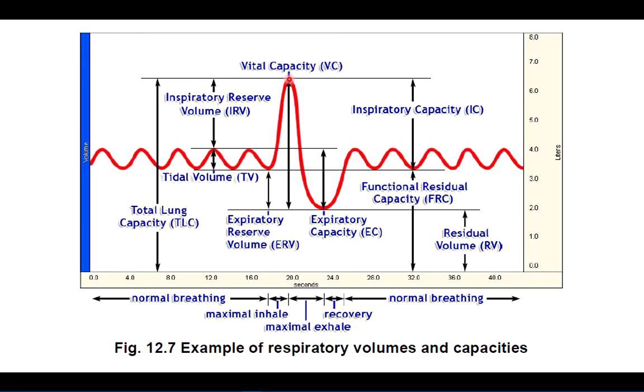So that forceful exhale should be done with as much air moving out of the lungs as quick as possible. So this breath out may not take very long, but it should be long enough that all of that air moves out.